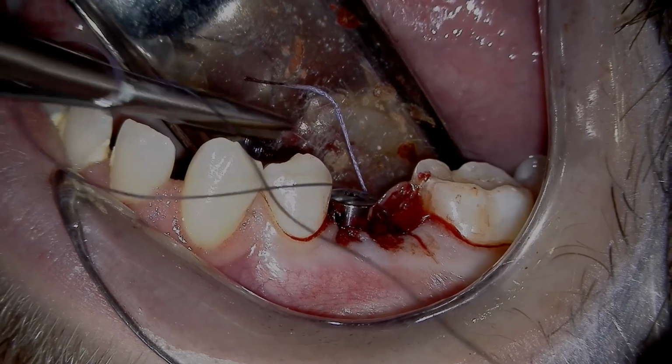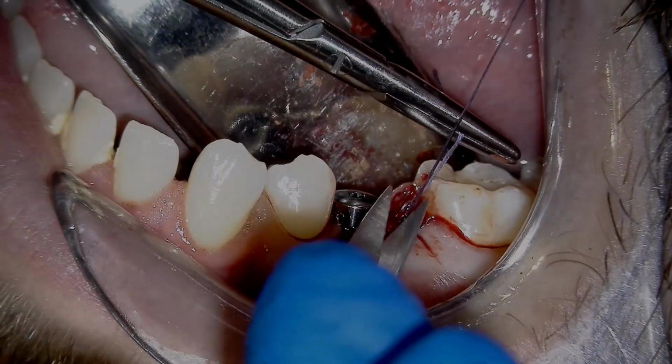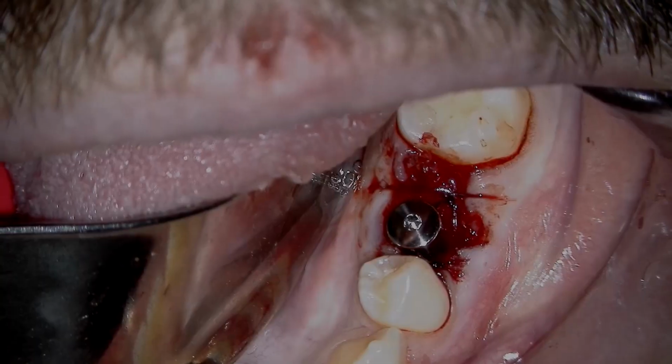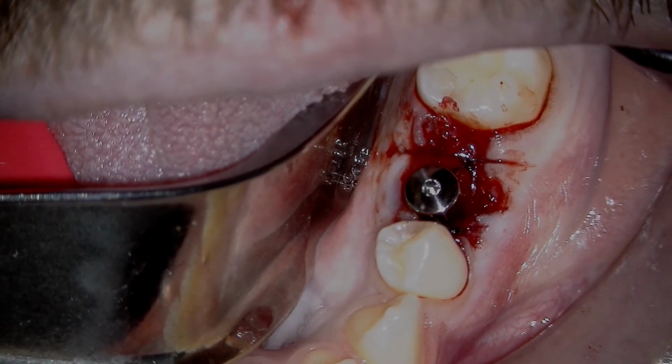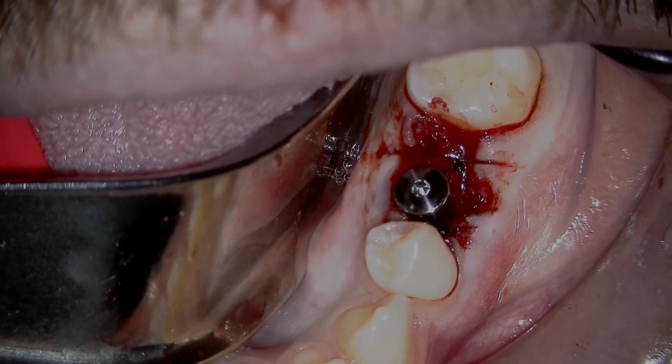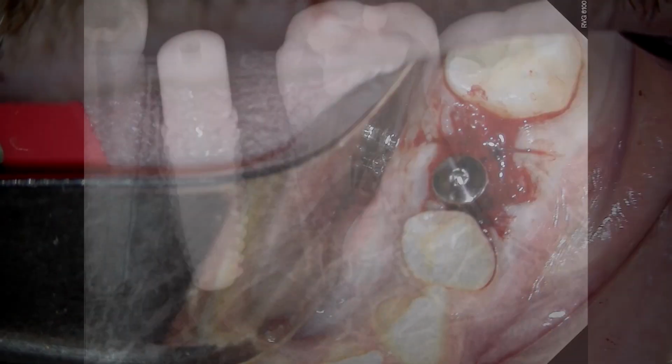Again, I'm doing very little suctioning because I'm working with the blood in this case. I just want the clot to form, to feed that graft and get that implant nice and tucked in. So there you go. That is it. It's very simple, very straightforward. It's an immediate extraction of a deciduous tooth. We'll see me in 3 to 4 months to see how it's healing and put a crown on.